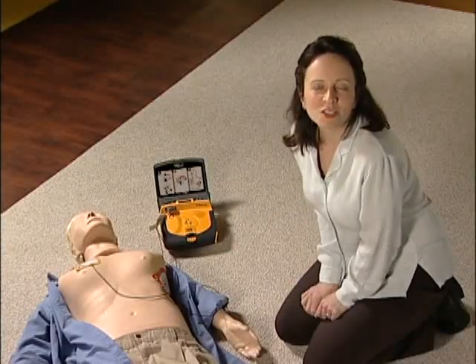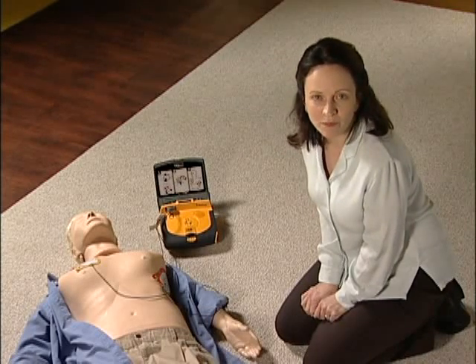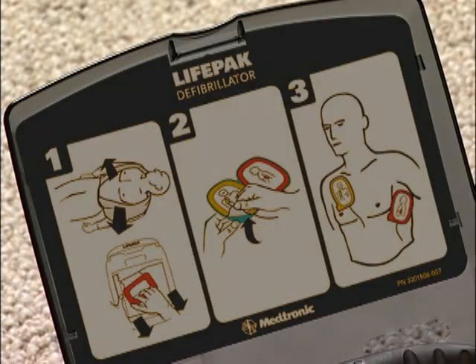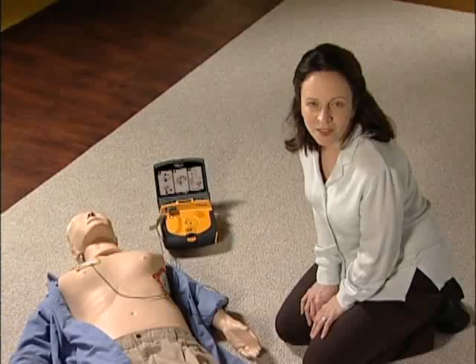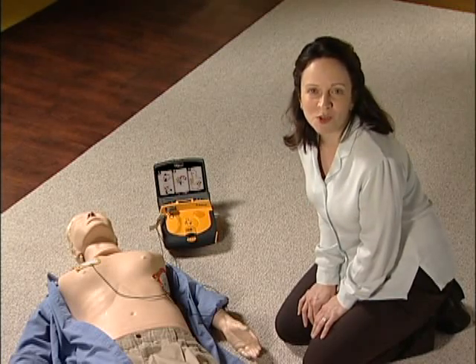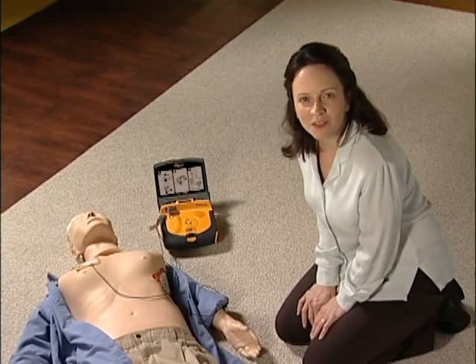The LifePak AED will keep monitoring the patient and will tell you if another shock is needed. And that's it — just do what the LifePak AED tells you from the moment you turn it on. You can also refer to the quick reference guide inside the lid if needed during an emergency. When the emergency medical team arrives, you may have saved critical time by starting treatment before they got there. Even better, you might have just saved a life.